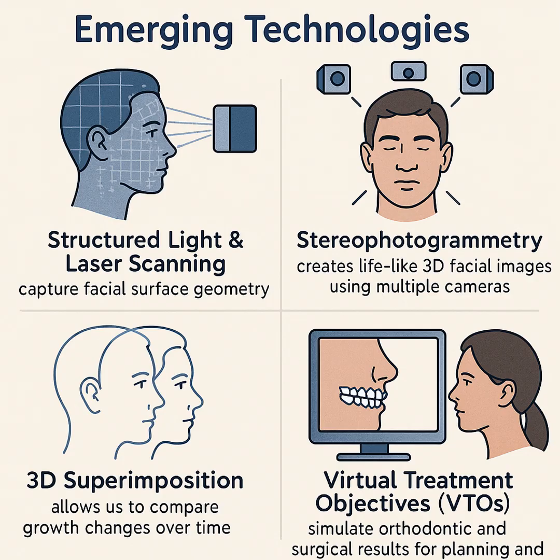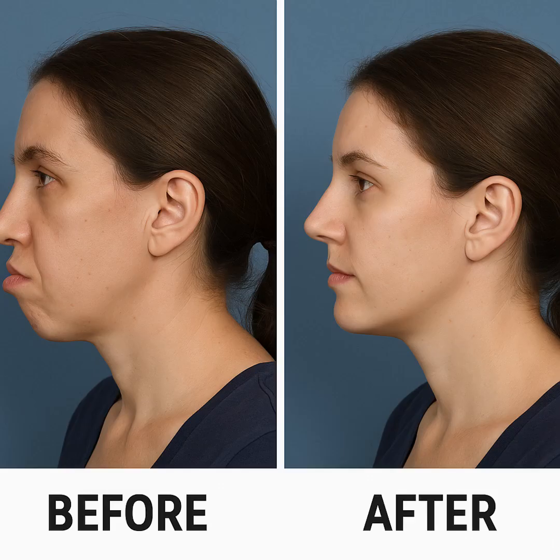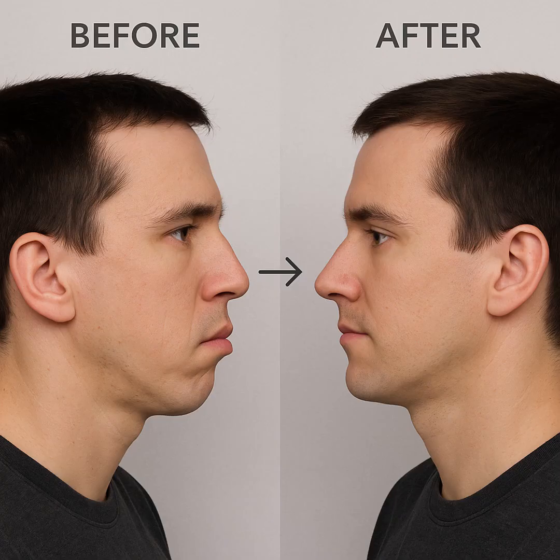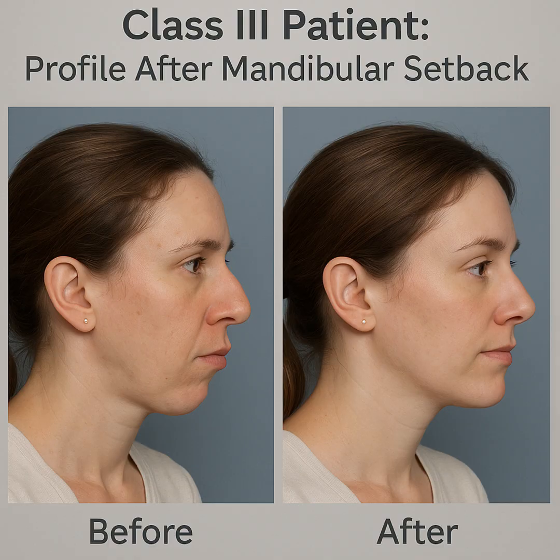6. Emerging technologies, structured light and laser scanning capture facial surface geometry. Stereophotogrammetry creates lifelike 3D facial images using multiple cameras. 3D superimposition allows us to compare growth changes over time. Virtual treatment objectives, VTOs, simulate orthodontic and surgical results for planning and patient communication. Example: showing a Class 3 patient how their profile could look after mandibular setback helps with treatment acceptance.